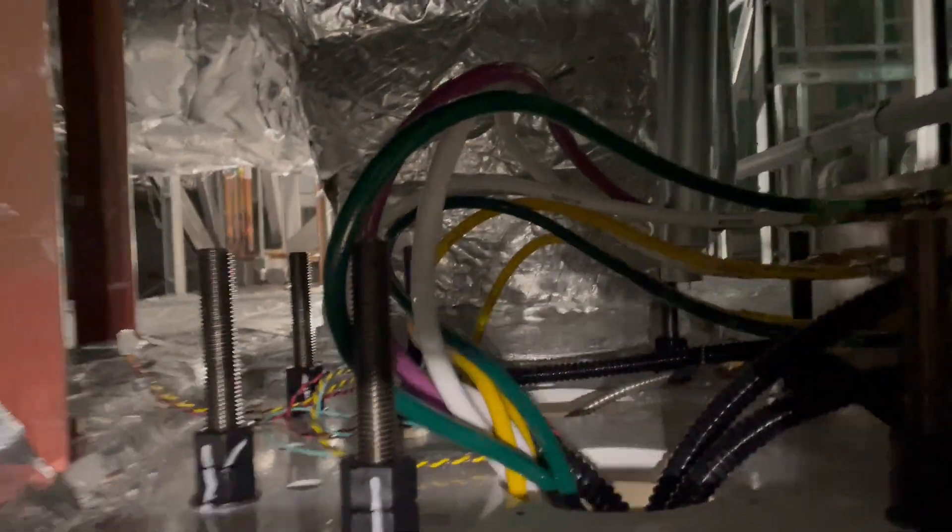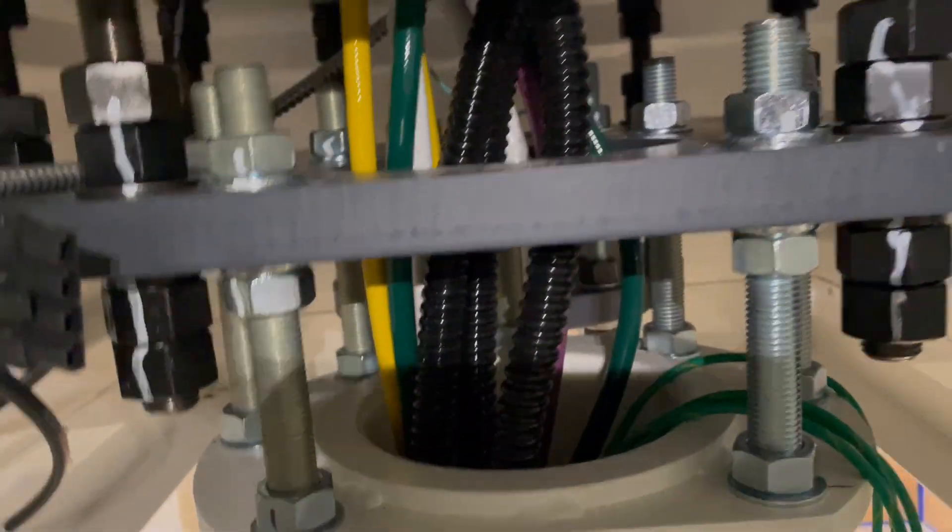That's it — I'll put these guys under pressure and then after I'm done I'll verify these don't leak. The crimp fittings might leak sometimes, so we'll see.